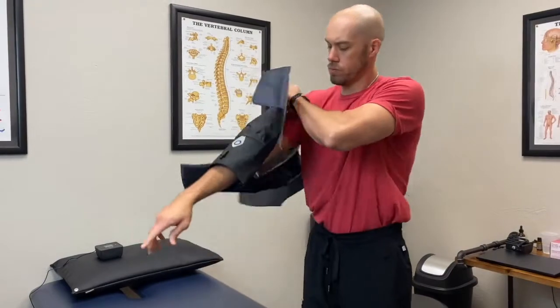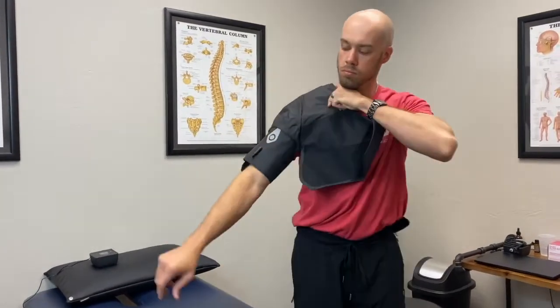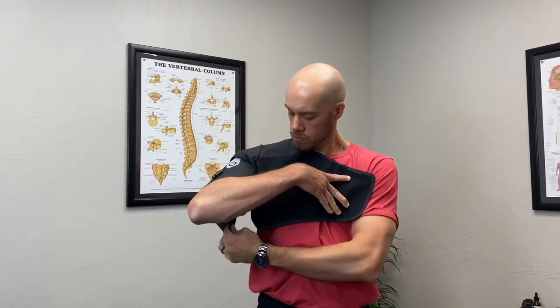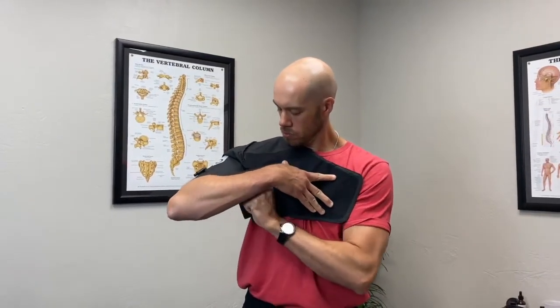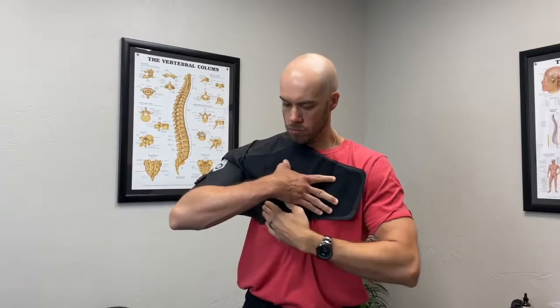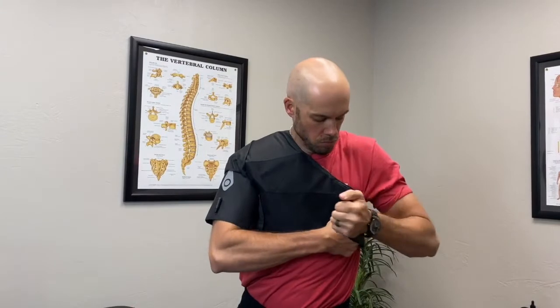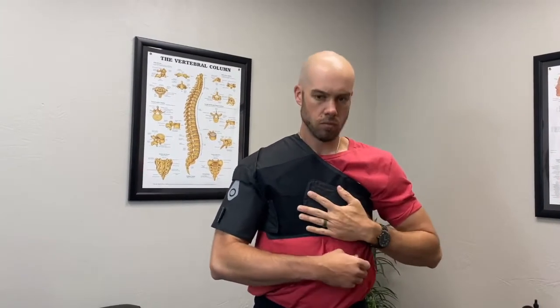Be sure to wear clothing under the wrap. As a reminder, I am using the right shoulder wrap. If you're using the left shoulder wrap, you would insert the left arm through the hole. There are now two straps behind you. Fasten the shorter strap under the arm receiving the treatment. Wrap the longer strap around your torso under the arm not receiving the treatment and fasten over your chest.